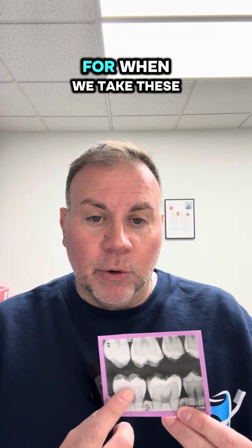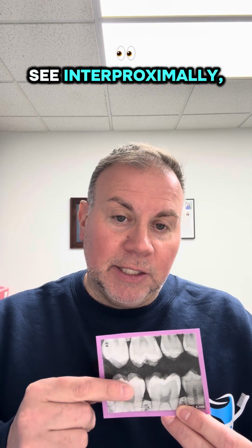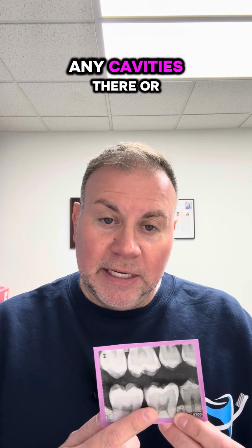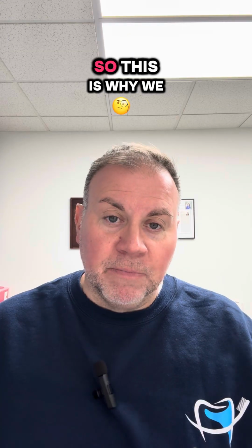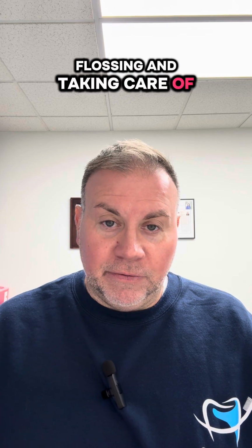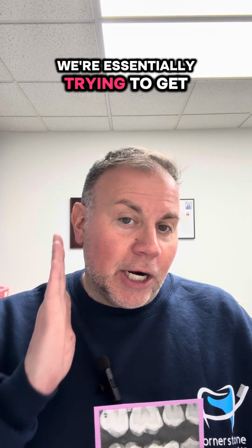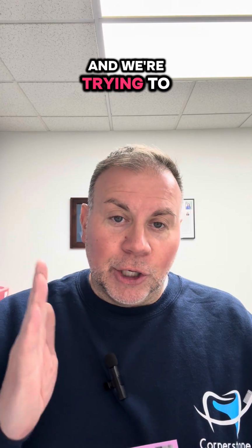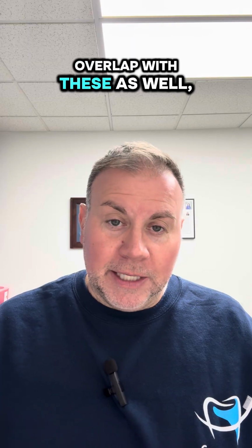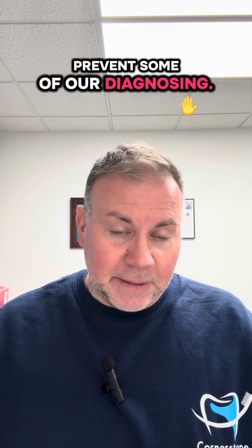What we're looking for when we take these X-rays is we're trying to see interproximally, so in between the teeth. It's going to show us if you have any cavities there or even starting. This is why we constantly preach flossing and taking care of your teeth. When we're taking these X-rays, we're essentially trying to get it parallel so that we can see in between the teeth. We don't want any overlap with these as well because that can prevent some of our diagnosing.